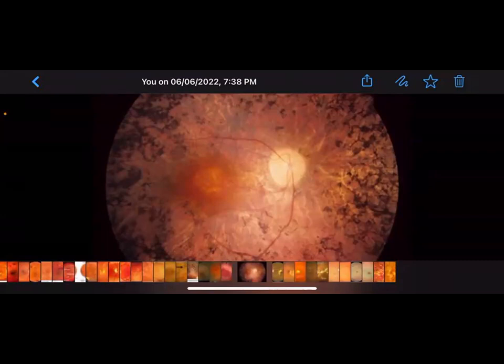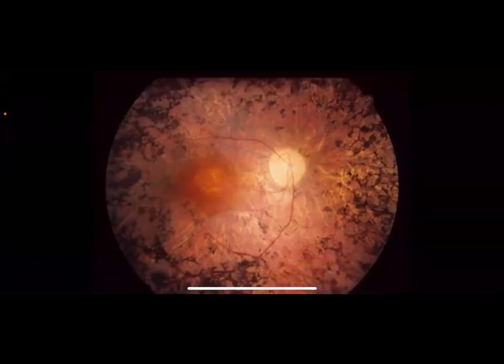Okay, if there are hard exudates affecting the macula, when the patient looks immediately into the light source, you will just feel as if the light is reflecting back. If you did not see any maculopathy before, you will think that the light source is just reflecting back from the retina. But actually, this might be exudate, hard exudate or yellow exudate. How to make sure that this is not the light reflecting back? Now you can reduce the intensity of the light. If the glare remains there, the same degree of glary yellow things are there, this is maculopathy.